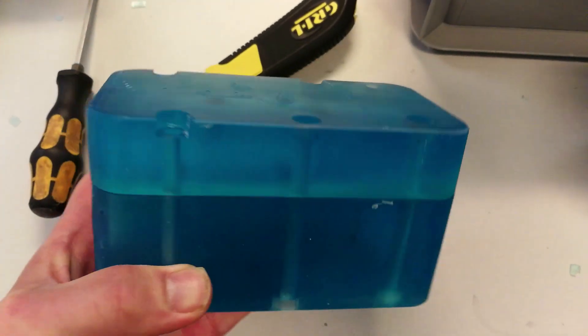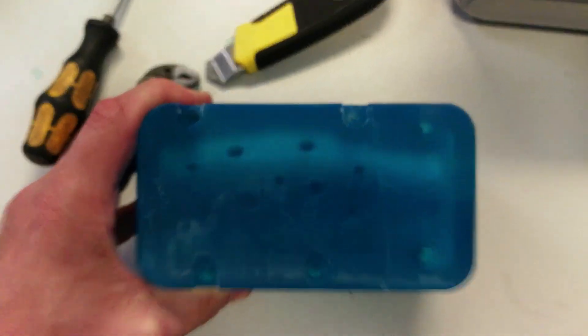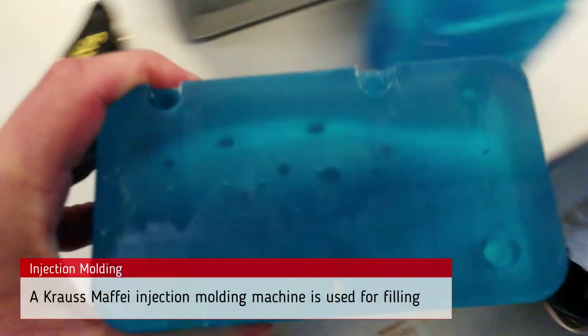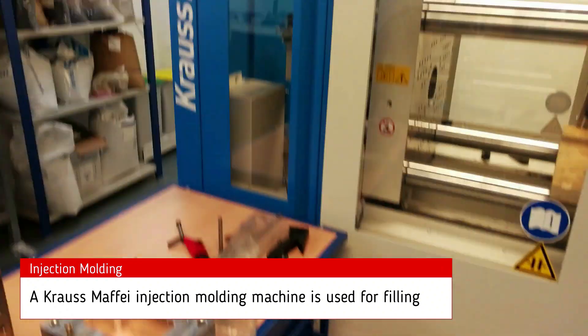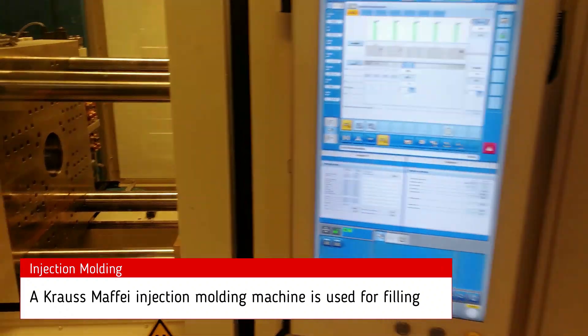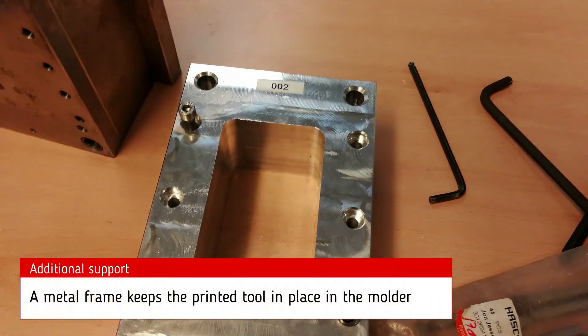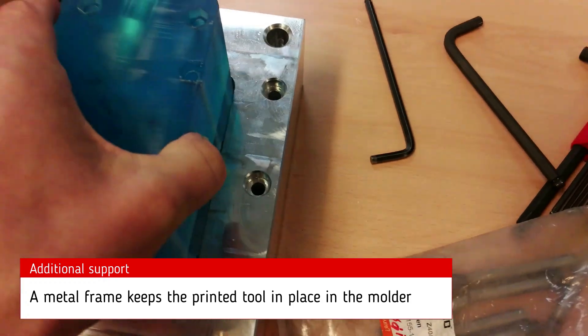In addition, we have added a few cores that are also intended to keep the mold in place. The mold will be filled using this little machine — a 50-ton press — and we are going to be using a metal frame like this one for keeping the mold stable.